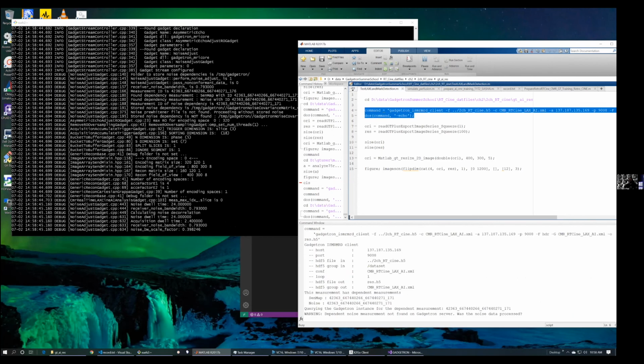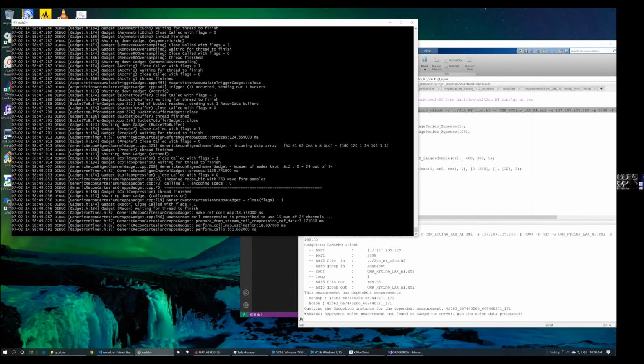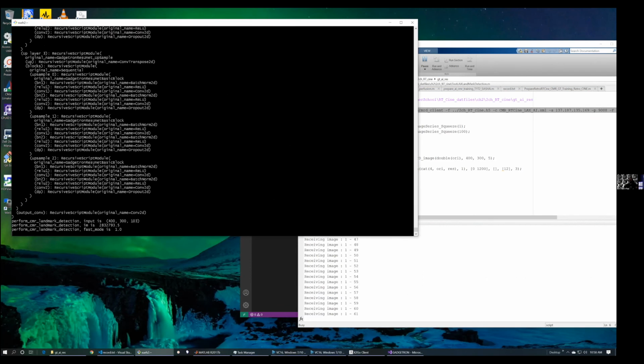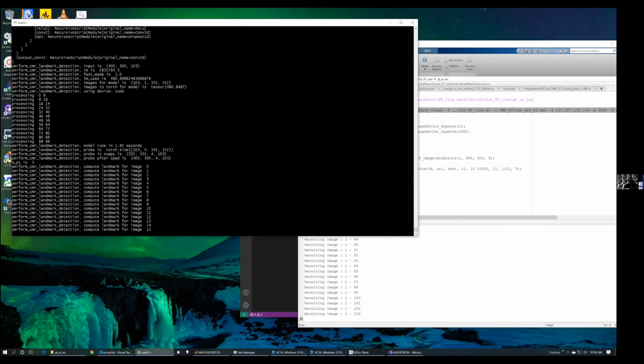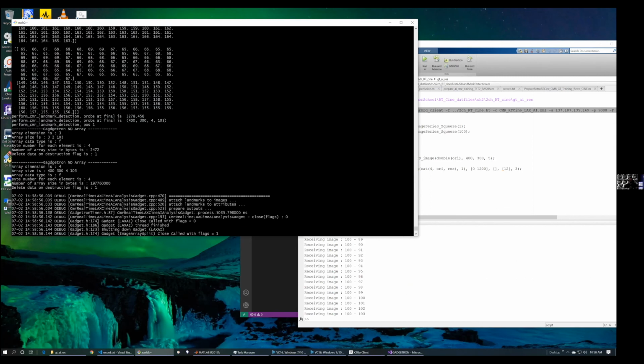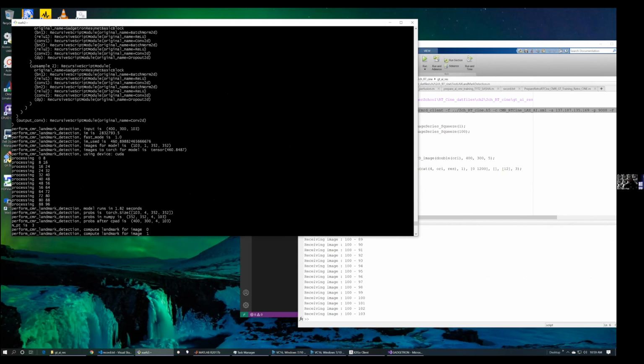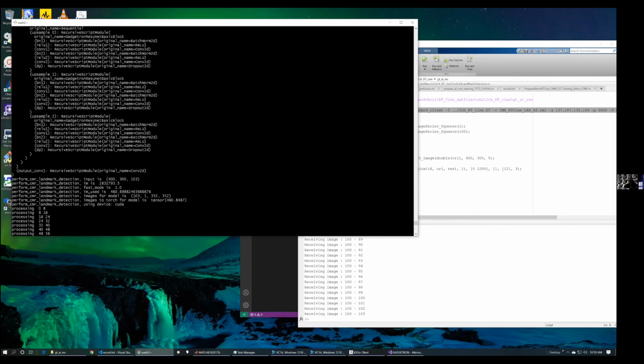Okay, so data comes through, then it will firstly go through the generic recon chain, as you can see. Then if you're loading the model, now it's applying model, then it's detecting landmarks, then send everything over. I have a GPU on this computer. You can see it's using device is CUDA, then process every batch. It's running like 1.8 seconds.